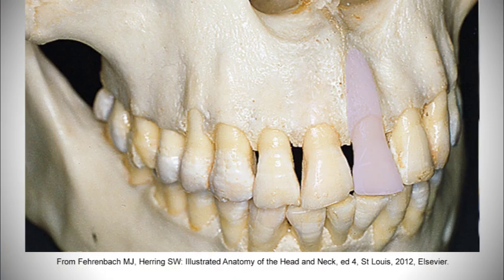In the maxillary arch, with its relatively porous bone, the anesthetic solution readily diffuses through the thinner facial plates of the maxillary bone to anesthetize the terminal fibers of the dental plexus. Therefore, the injection can be used on any tooth. However, because the anesthetic is deposited in close proximity to the area of treatment, any severe inflammation or infection in the area may inhibit the achievement of profound anesthesia.